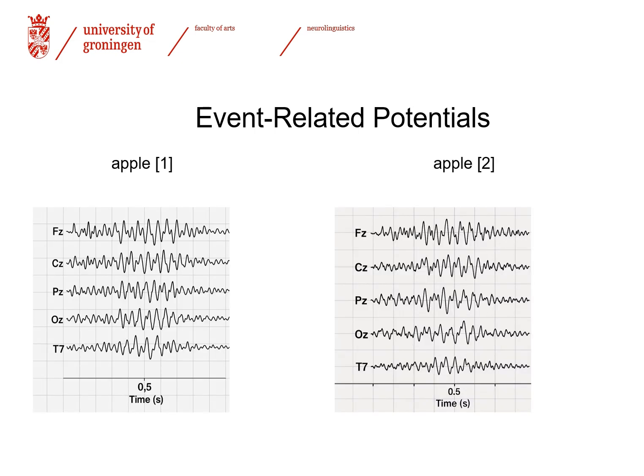So what we are going to end up with then are two event-related potentials, one for apple 1 and one for apple 2. Mind you, this is the electrical brain activity from, let's say, the visual onset of apple 1 and then another one for the visual onset of apple 2. How is this of any use to us? Well, we can try and overlay the two and check for any differences in activity between the ERP for apple 1 and apple 2.